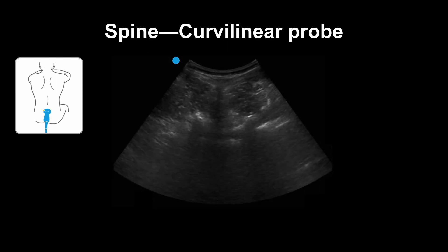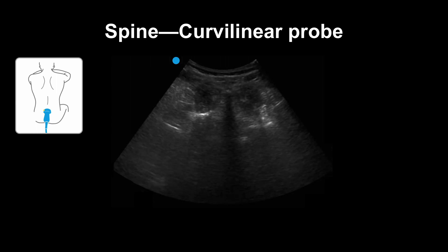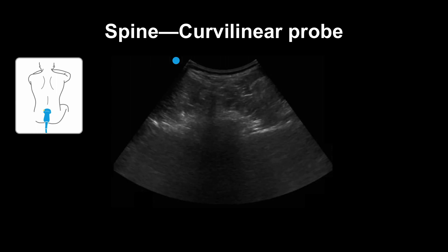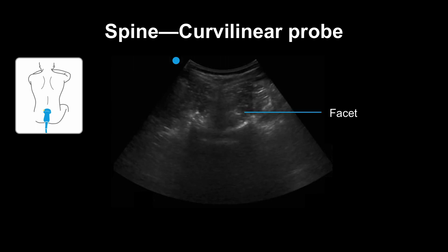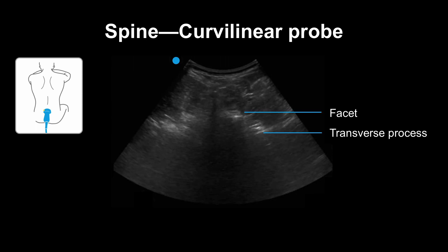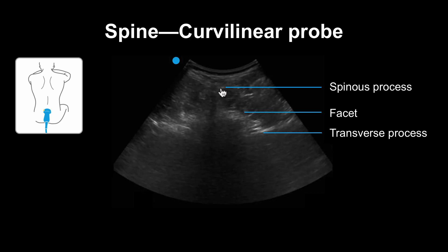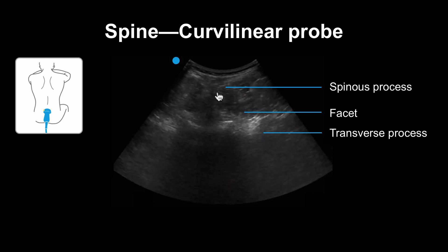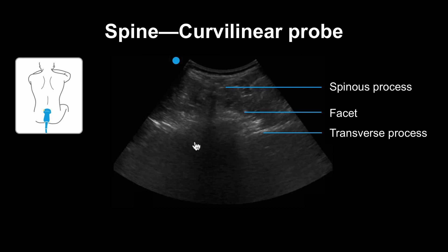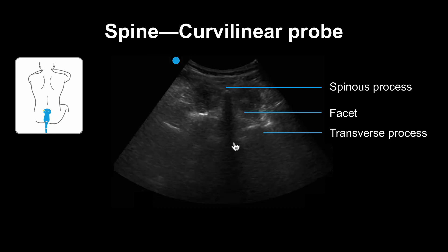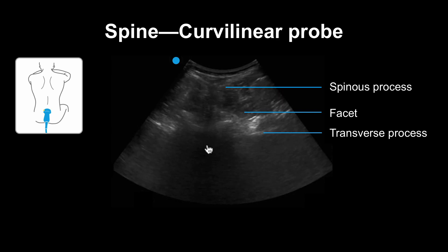Sometimes we use the low frequency curvilinear probe to get these views. On this clip, the operator is sliding the probe in the transverse plane. Here you can see the facets, the transverse process, as well as the spinous process. The spinous process here may appear to you like a steeple. Here you can see the vertebral body with its hyperechoic top and corresponding shadow downward.